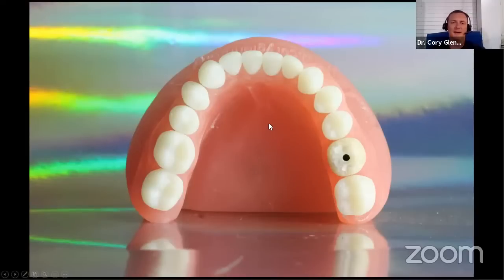And just a quick aside on that, the thing I would recommend doing if you're placing implants and if you have an intraoral scanner is to do a pre-op scan. Go ahead and do a pre-operative scan of both arches and your buccal bites so that that's all done. And then come back before finishing up. Once you've placed the implant, just cut out the little area where that scan body would be protruding and then fill that area back in with a scan body on the implant. You still flap open, all of that, but it'll only pick up the scan body if that's the only area you cut out. Because what you've created with that one little step that just takes a minute or two is the working model, so you could design their final restoration before they even have their second stage uncovery.